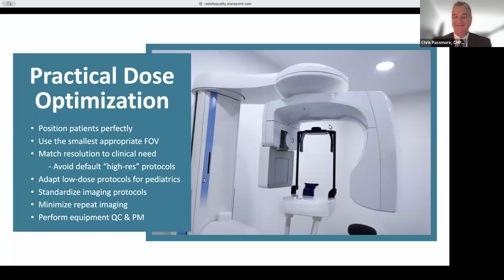Sorry. Okay. I just wanted to elaborate a little bit on the word optimization. Quite a few sites I went to always just talk about reducing the dose. Optimization is totally different than reducing the dose. And to be honest with you, in my experience of doing CT dose optimization, on some occasions I would have to increase the dose to give the radiologist good quality images.